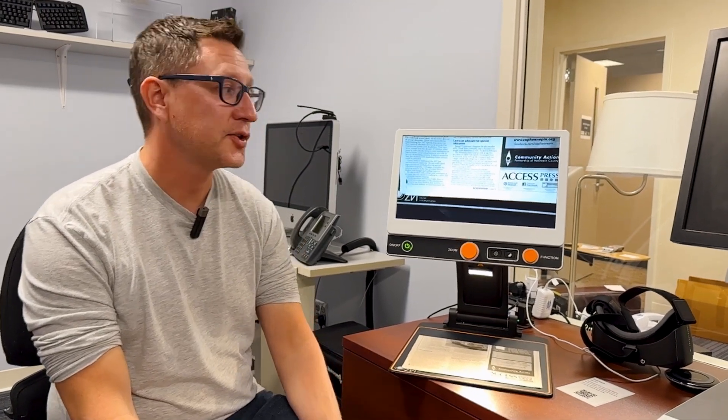Hey everybody, Jameis Wehrenberg here with the Minnesota Star program. Today I wanted to show you an awesome desktop digital magnifier called the MagnaLink.